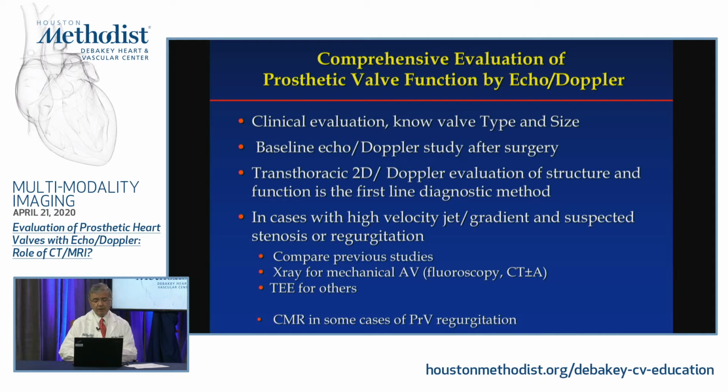And CMR, and we'll talk about CMR also today with Dr. Shah about prosthetic valve, not only regurgitation, but I think this is where the limitation of echocardiography could be in quantitation of residual or new regurgitation in prosthetic valves.